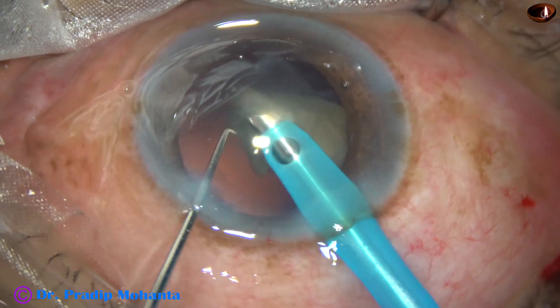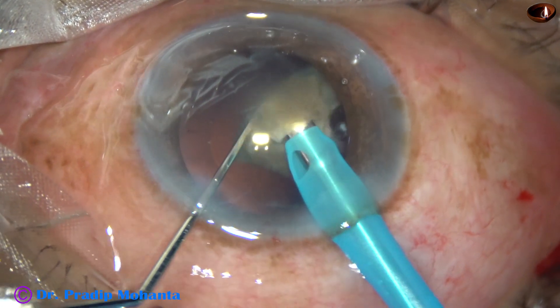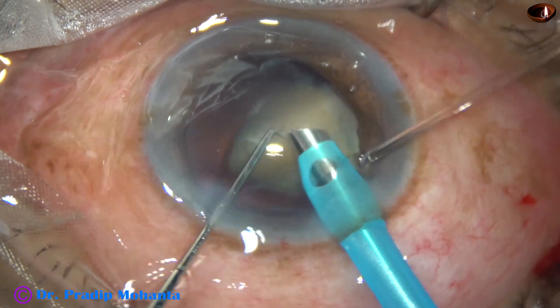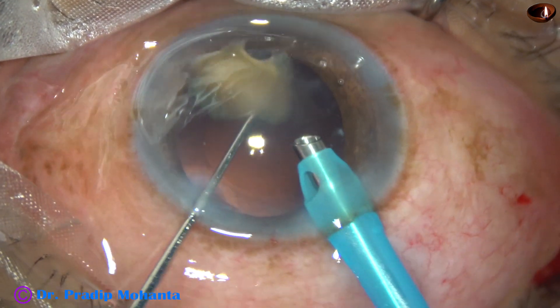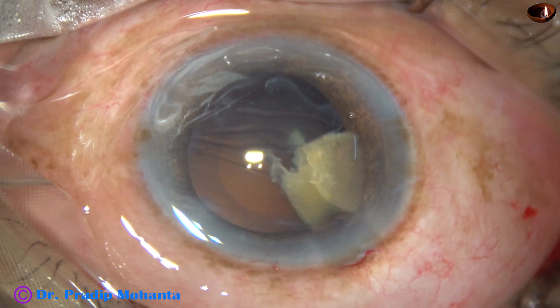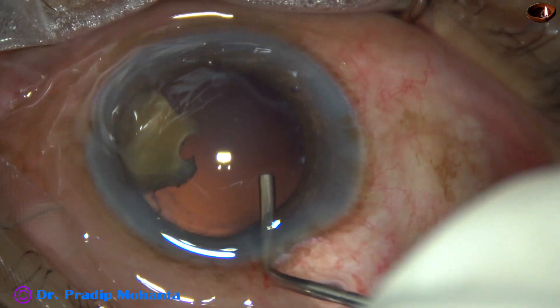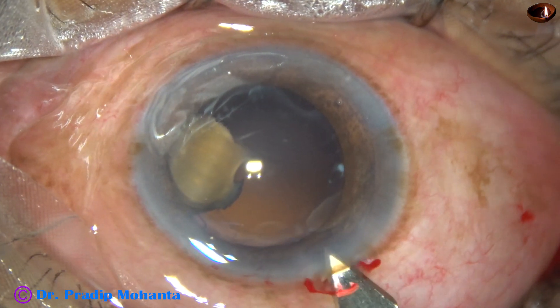Friends, we have to increase our skills. Don't wish it were easier — wish you were better. Don't wish for less challenges — wish for more skills. This is a great quote by Jim Rohn, which I always keep in mind. Now, I don't want to emulsify this last bit of nucleus directly. Already there is zonular weakness, so I want to use the IOL as a scaffold and emulsify this piece over the IOL.